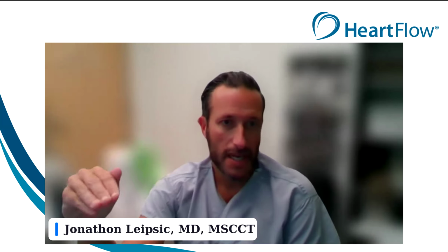But before I do, I think both of you highlighted the fundamental importance of tool validation. We have a lot of tools in imaging. I'm a radiologist by training, as you know. There are many tools out there for lung nodule detection, stroke detection, and intracranial hemorrhage detection. One of the things I like to teach our fellows and residents about is the fundamental importance of the hierarchical evidence required to integrate a tool. You need to show that a tool is first reproducible and accurate. Then, of course, you can explore the risk prediction and clinical utility, and then the prospective integration.